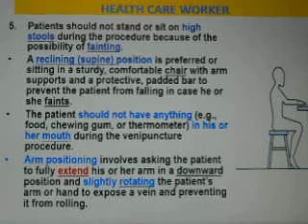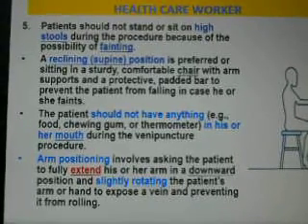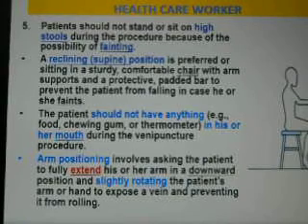And these are some things, positioning of the patient and the healthcare worker, that you want to follow. I don't want to read each one of these to you, but the main thing is you want to make sure that patient is safe and comfortable, okay? You want to make sure that they're sitting down or lying down, because a lot of people have been known to either pass out or faint, and you would not want them to be in a seat where they could fall out of it and hurt themselves, okay? They shouldn't be chewing anything, food or gum, or have a thermometer in their mouth while you're performing a venipuncture, okay?